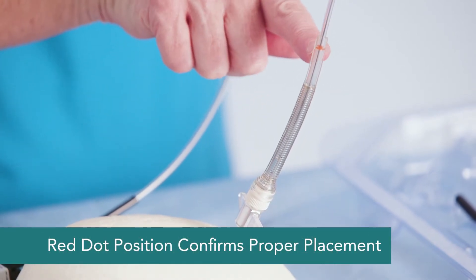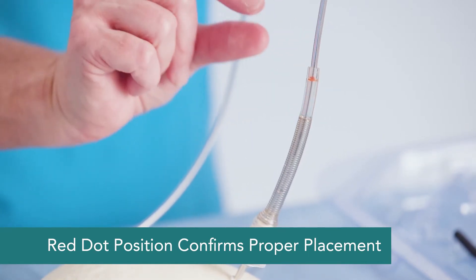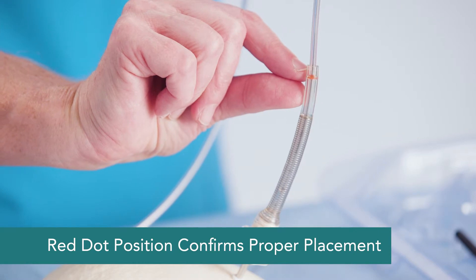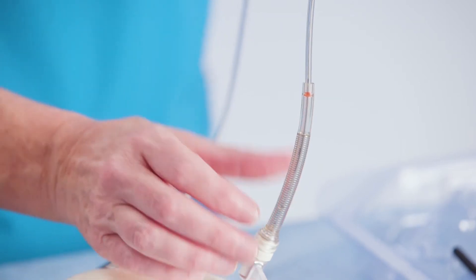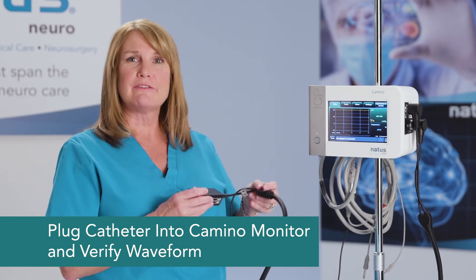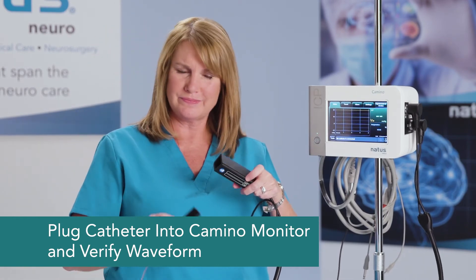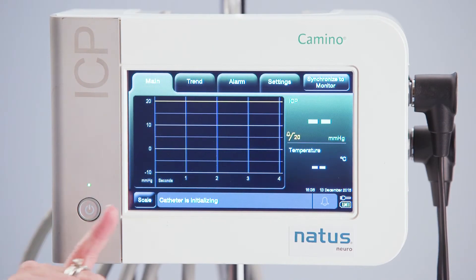You can see by this red dot that the catheter is appropriately placed. We want that red dot to be somewhere in this window — it indicates that the catheter is actually in the brain where it's supposed to be, rather than outside of the parenchymal tissue. Once the catheter is placed into the bolt, connect it to the Camino monitor, verify the waveform. It will say the catheter is initializing, and then pop up with the ICP value and the waveform.